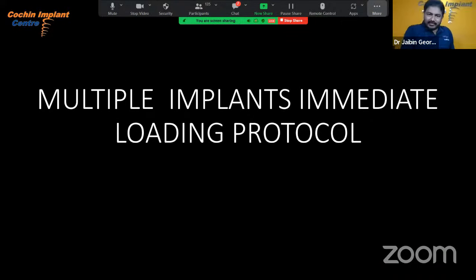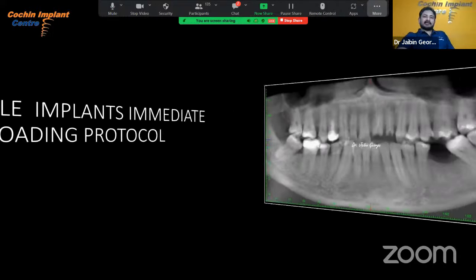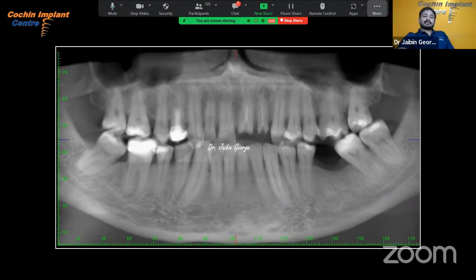Now I want to discuss with you multiple implants, how to load multiple implants. Sharing a case where the central and lateral incisors are fractured, previously root canal treated. And you can see there is some periapical lesion at the lateral incisor apex. So the plan was to extract and place 2 implants and load them immediately.